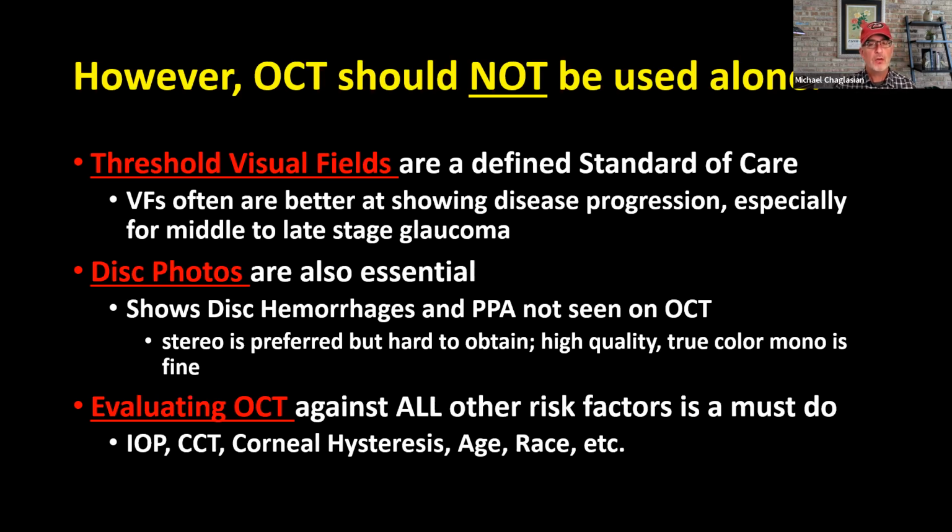So if you're managing glaucoma patients, you need a baseline of several fields up front in order to manage this disease in the middle to late stages, before you might be sending it out for a surgical procedure, a laser procedure, or something like that. Disc photographs also, OCTs are not a replacement for disc photographs. Disc hemorrhages and peripapillary atrophy are not seen on the OCT. You really need some type of good quality digital photograph.